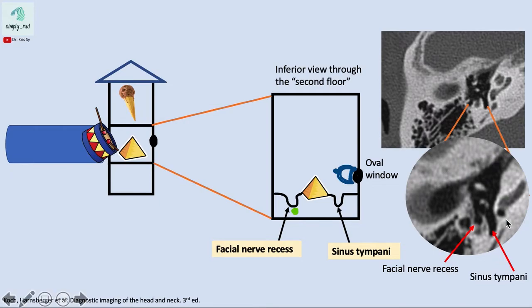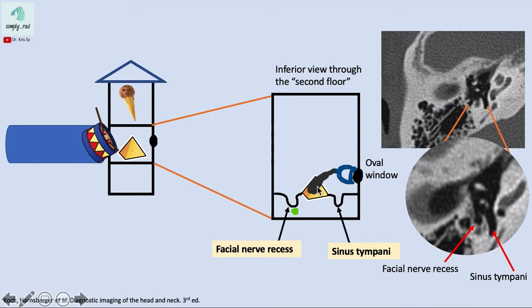Looking at the pyramidal eminence, it contains something special: soft tissue density within the pyramidal eminence. This is the stapedius muscle — specifically the tendon and belly of the stapedius muscle.